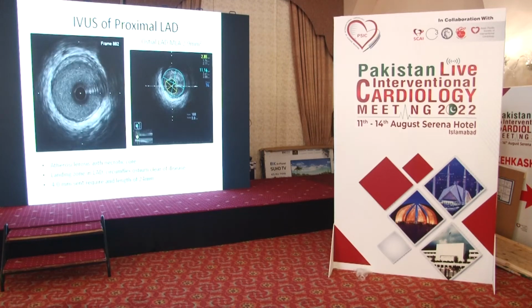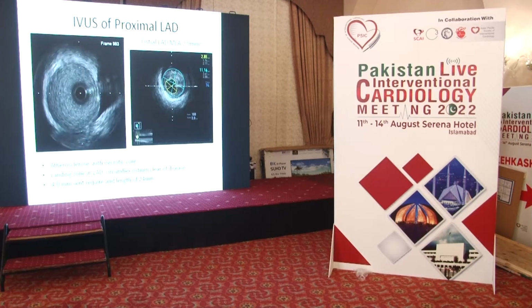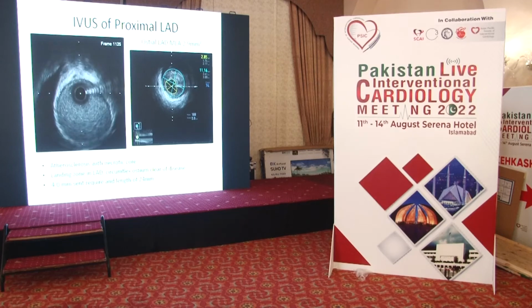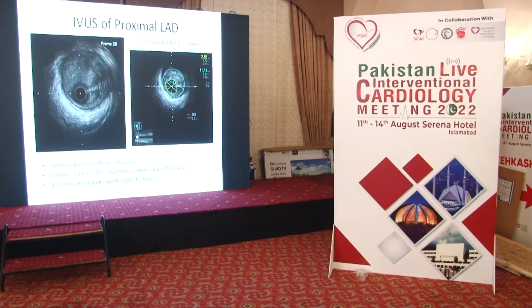Okay, so you can see here, this is Boston IVUS, so you will have a wire drop out as a result, and we're coming now into the proximal vessel here, which looks pretty normal, doesn't it?